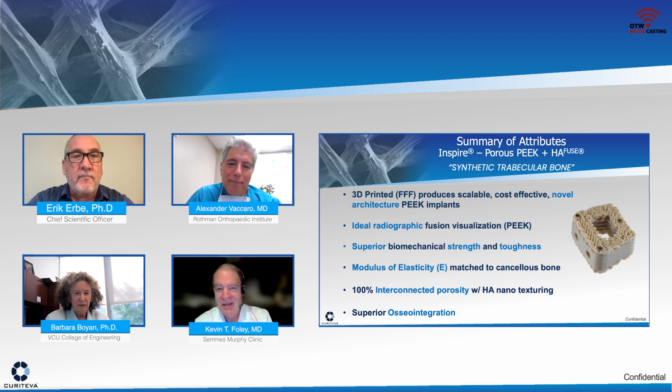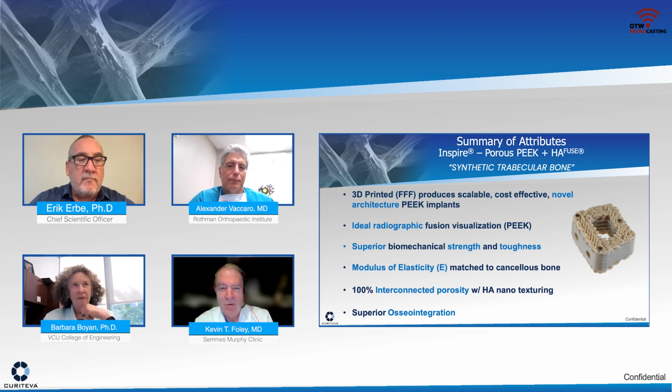For example, I'm not sure you need the graft window here, right? What I'm seeing so far is I'm seeing bone grow through this material. And so why have the graft window? That's an area in our interbody implants that doesn't immediately load bear very well. And we know that if we can spread the load over a greater surface, right, reduce the stress on those end plates in that fashion, that alone should diminish subsidence.